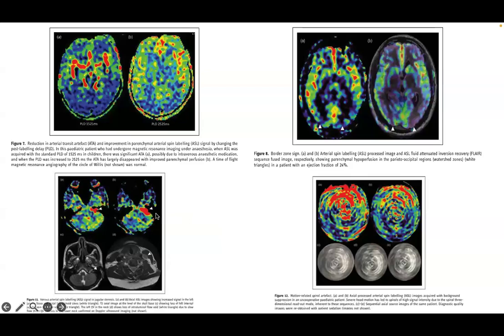Another thing is that this jugular, sometimes it will come. And you tend to misinterpret it as an arterial venous connection here, as well as a jugular dural fistula here. So dural fistulas can be missed. But the problem here was there was a physiological narrowing of the distal jugular vein. So because of that, with every Valsalva, every breath, the venous reflux was going up. In most of the patients it can happen. So if you're tagging in that plane, even that venous signal can come. What you can do is increase that tagging plane a little up. This will disappear. So all those things, technically it is very demanding.